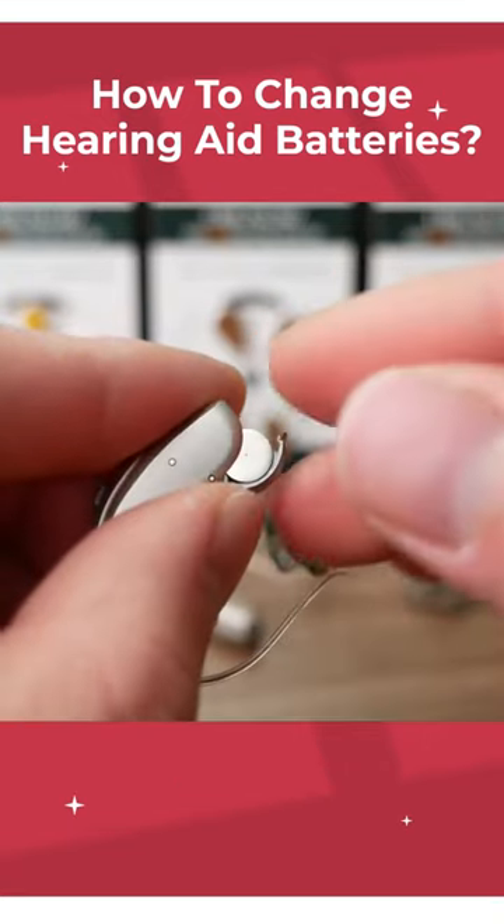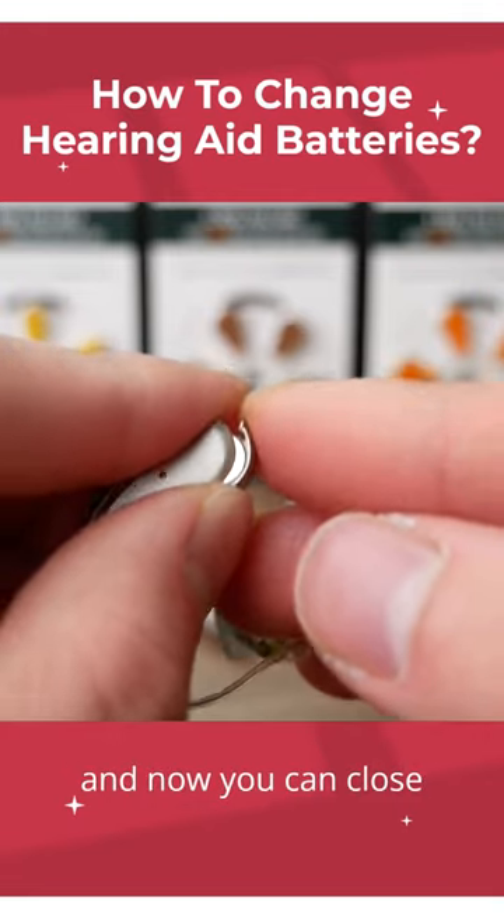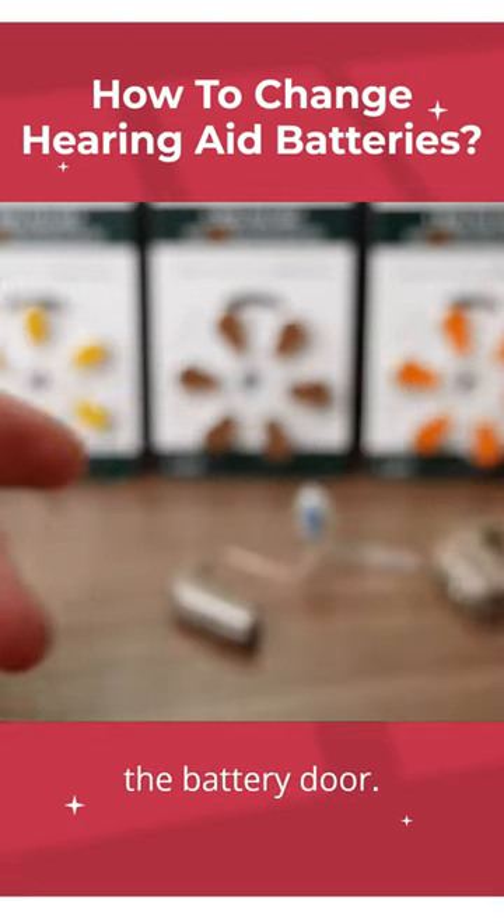And peel. Wait for a few seconds and now you can close the battery door.